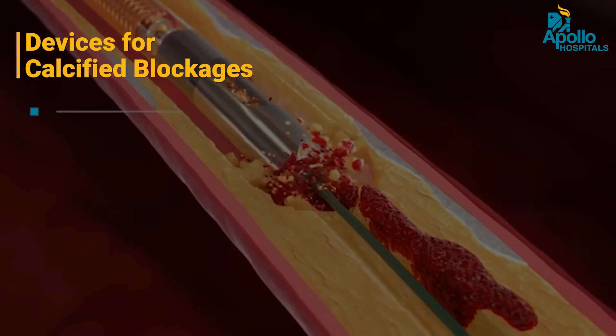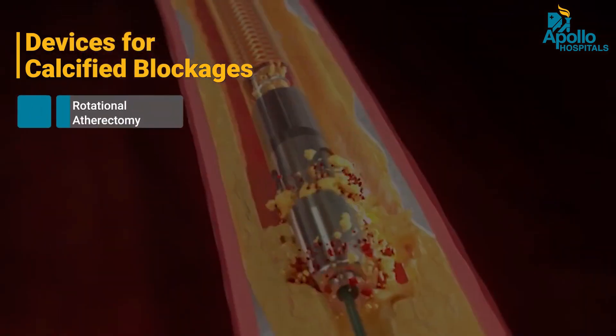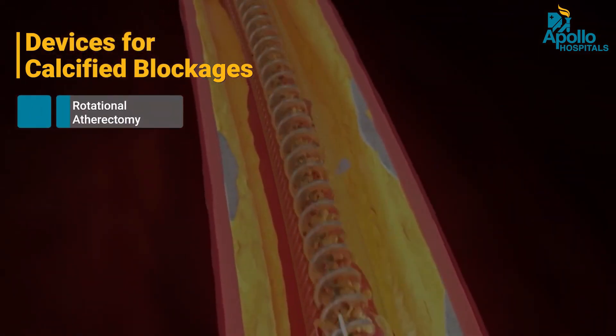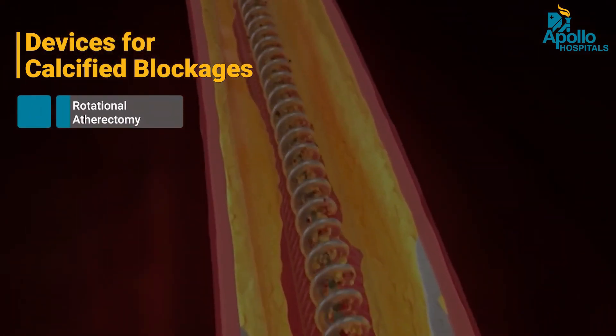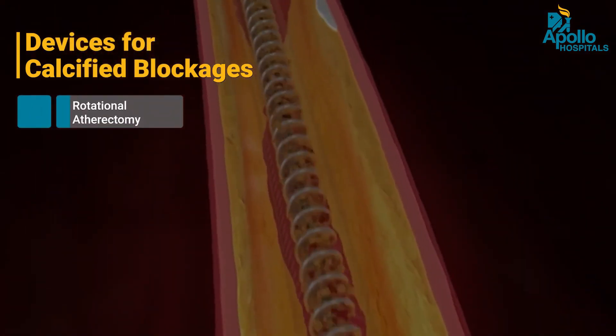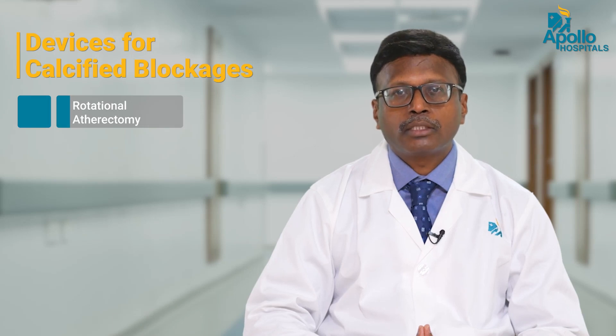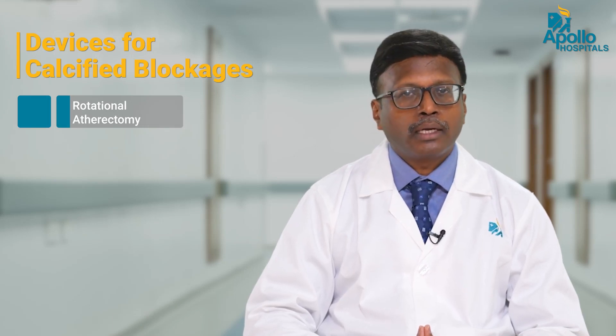There are specialized procedures for calcified lesions. One is rotational atherectomy, where a diamond burr rotates inside the blood vessel at 180,000 RPM. It cuts the calcium into very small pieces — less than eight microns, smaller than the size of red blood cells. Then we proceed with balloon dilation and stenting.